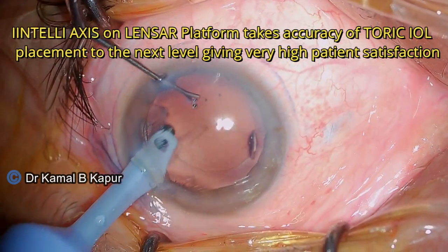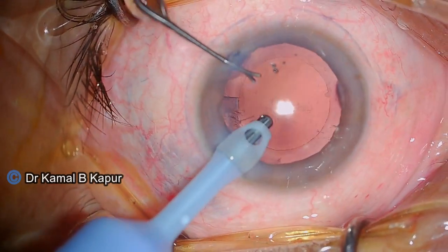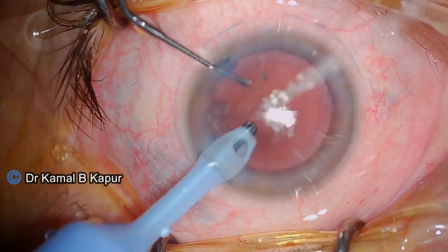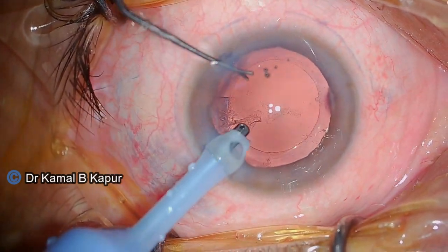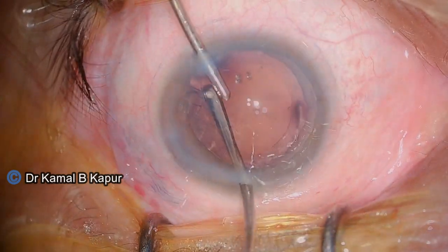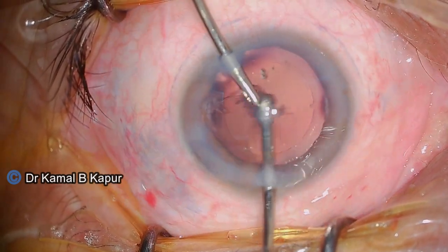Sometimes when this sticky cortex in the subincisional area is difficult to get hold of, it is a good idea to shift to bimanual irrigation aspiration to remove it. So we proceed and convert to bimanual irrigation aspiration and remove the remaining cortical matter.